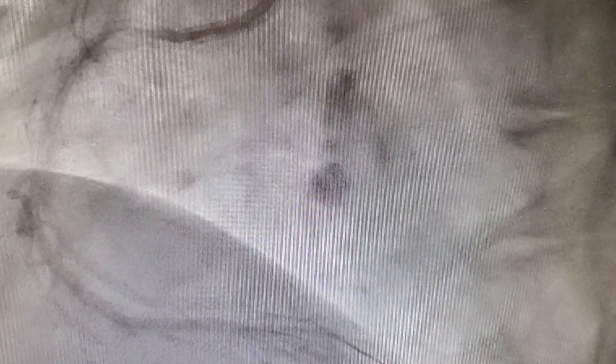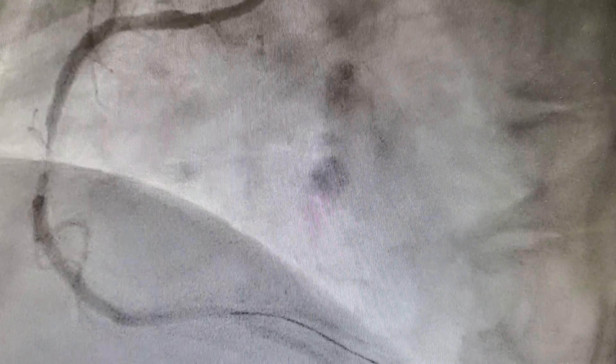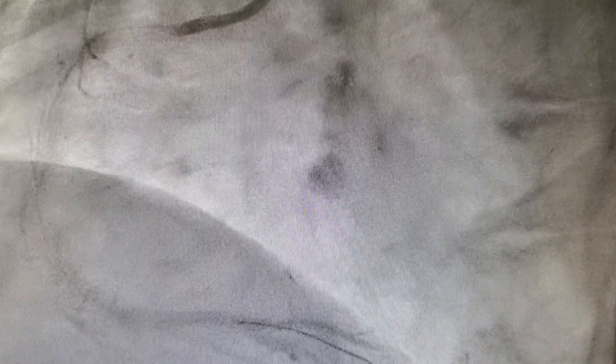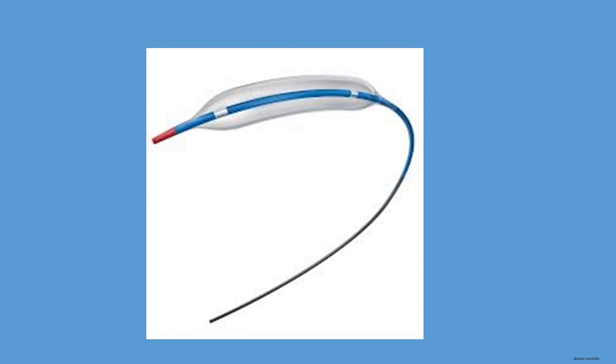A special wire is then passed through the blockage. This wire is known as the guide wire. You can see in this video that the wire has been passed through the blockage.